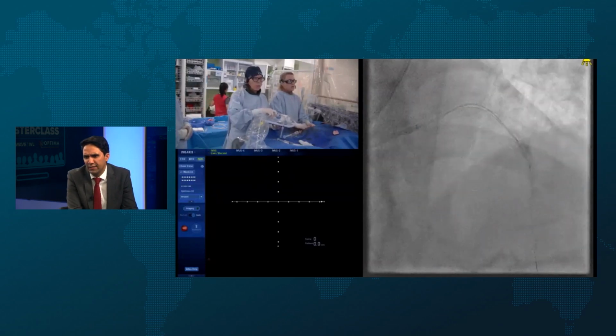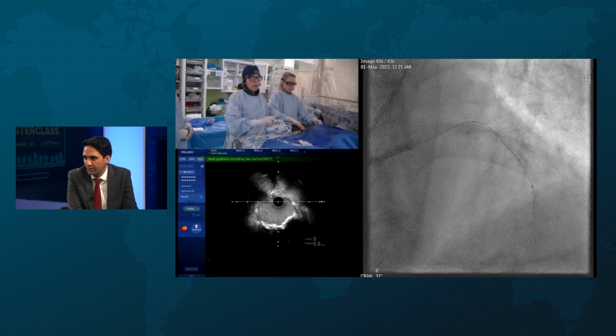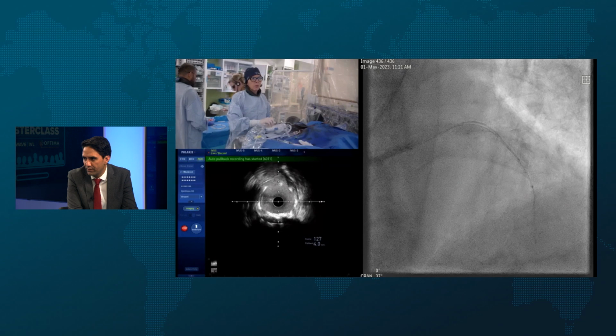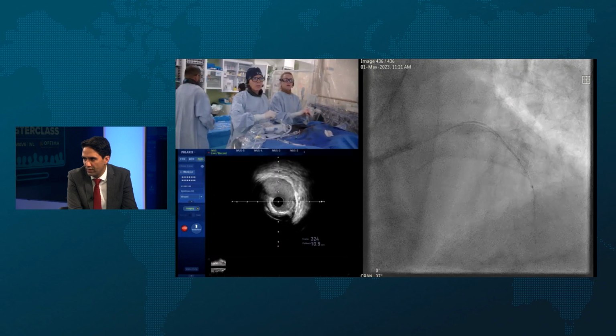Okay, we're going to go from here and get a proximal length measurement. Great. That's us in the front end of the other stent. Did you take that front end up with a 3.5? That looks very good. Okay? Another slit. There's your flap.